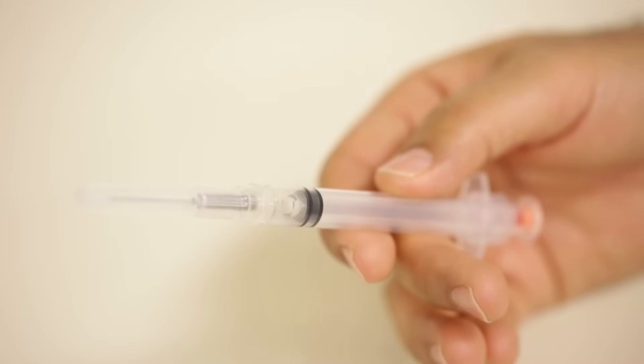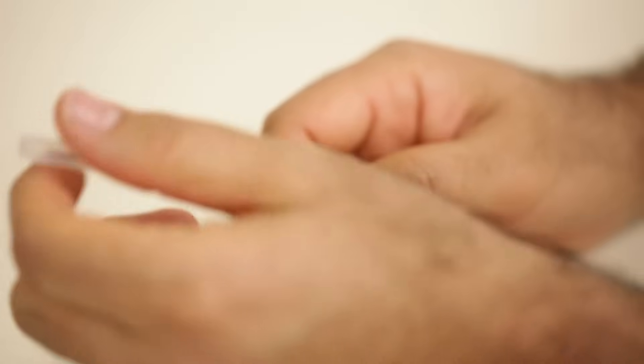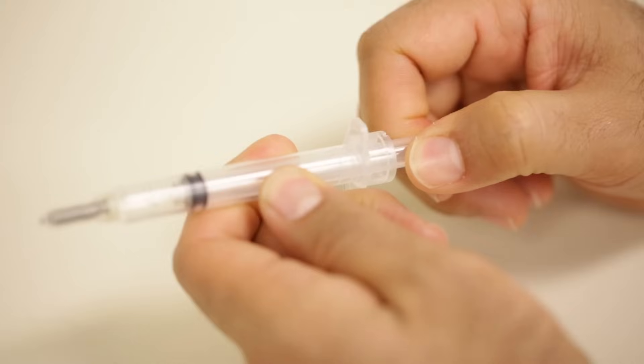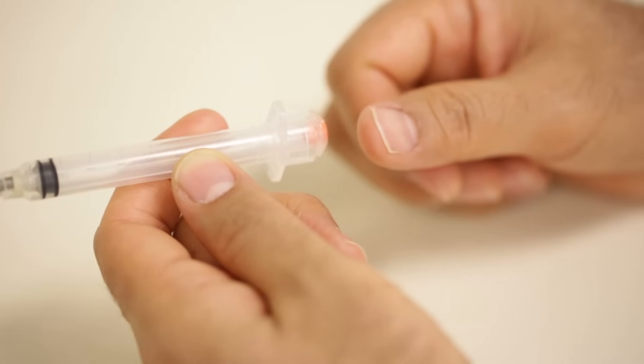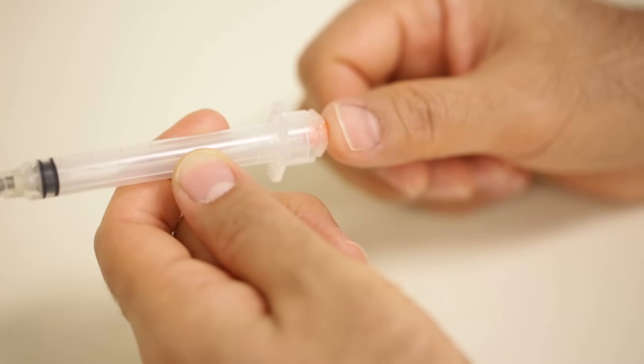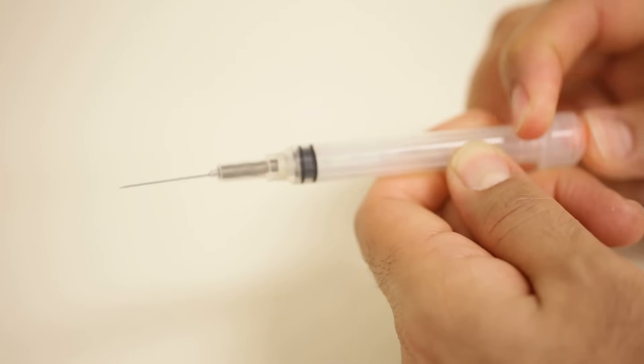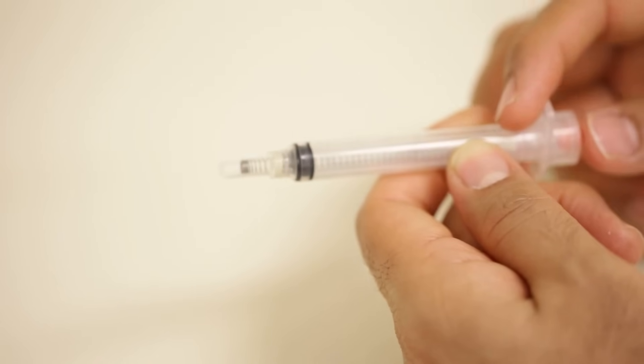This syringe can be used only once and helps prevent sharps injuries. Remove the cap and draw the medicine into the syringe. After the injection, push the small button at the end of the plunger which forces the needle to retract inside the barrel.